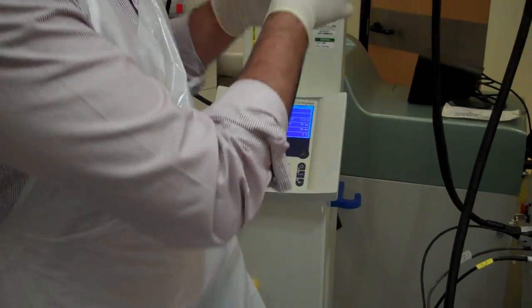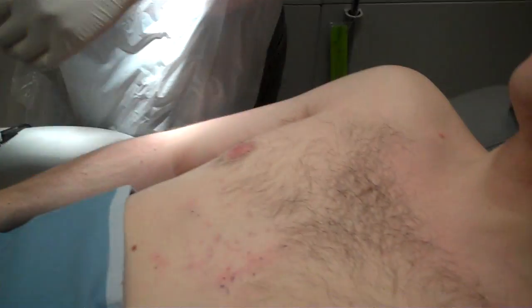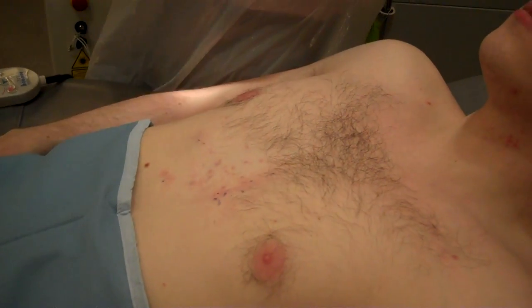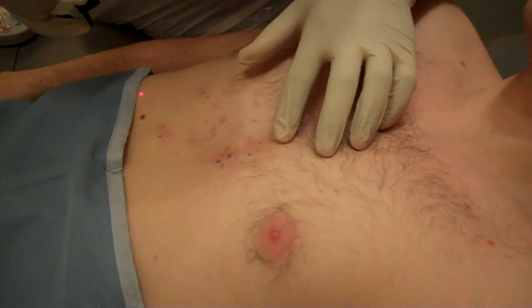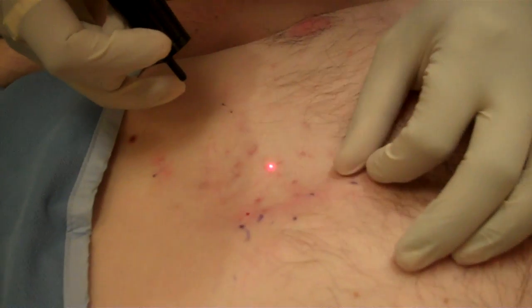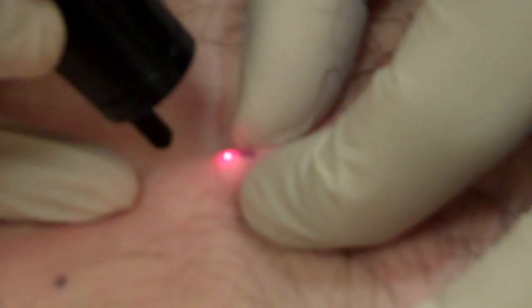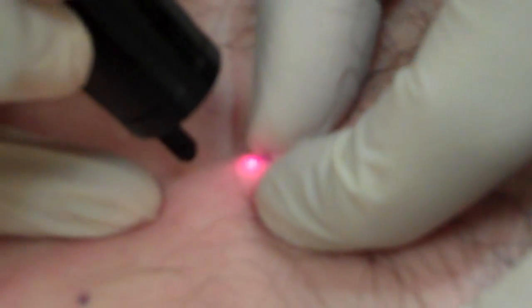So we're going to start with the laser. I tend to pick the lesion to make the surface more prominent, and you can already see the contents being squeezed out.